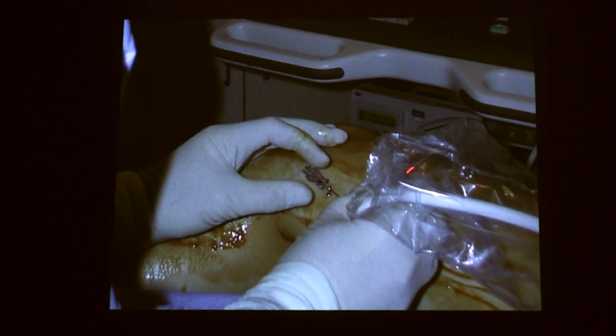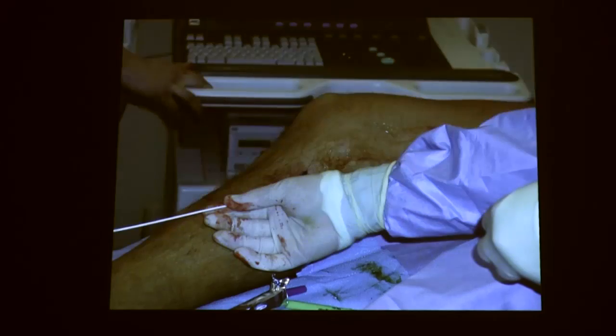And here we're using ultrasound to guide a needle into the great saphenous vein, which is running on the inside of the leg. And I bet if I had asked you that, you would know that now, right? Because it's a vein on the inside of the leg. Here's the knee. I use ultrasound. I'm a radiologist. We use ultrasound. And I'm poking a needle. You can see a little bit of blood coming back at me, so I know I'm in the vessel.